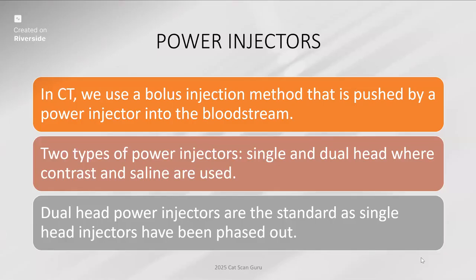And even him saying it was really hard to push, like he cracked that syringe. And him and the ICU nurses that were with this baby that we were doing this cardiac scan on, they said, now we understand why you guys request the IVs that you do. So it was a very positive learning experience, considering we went back and forth with them, when they physically saw how hard it is to push it and why we asked what we asked for, because we need to power inject it. They understand why. Now they don't give us a hassle anymore.